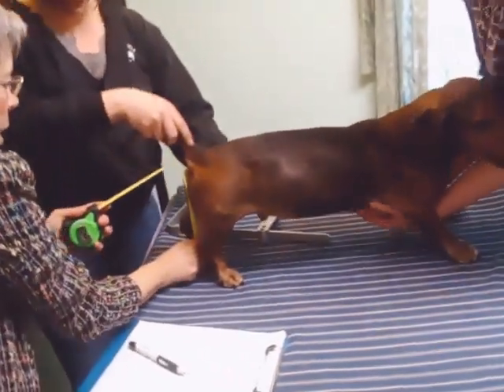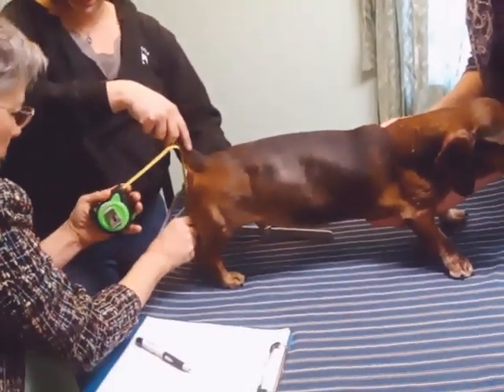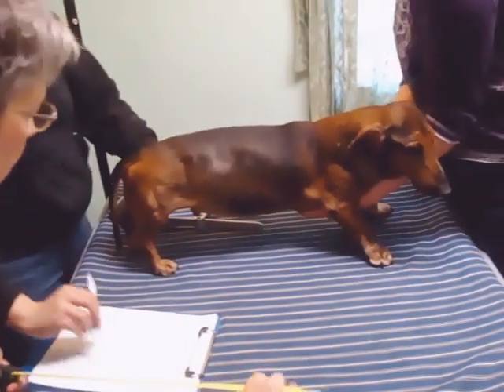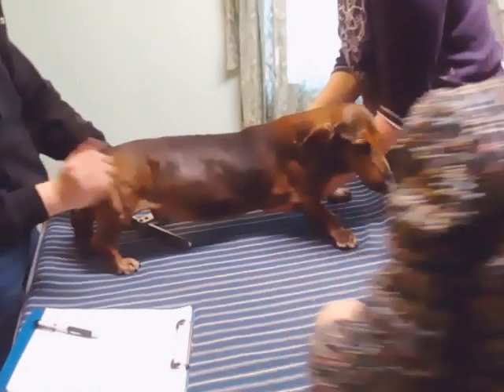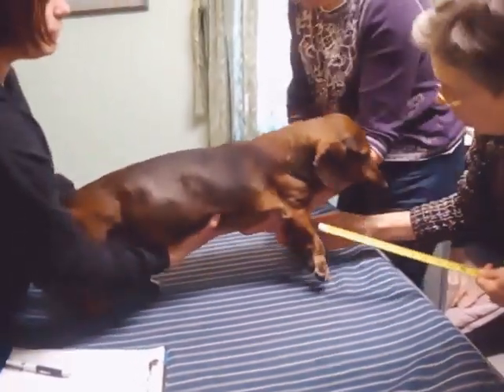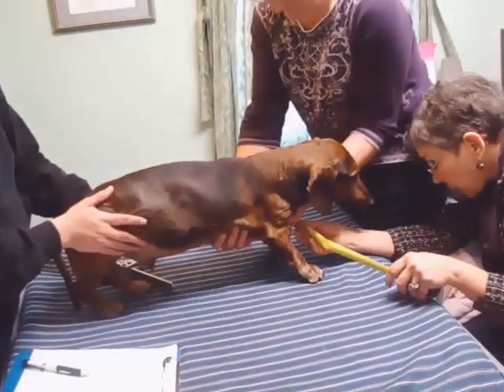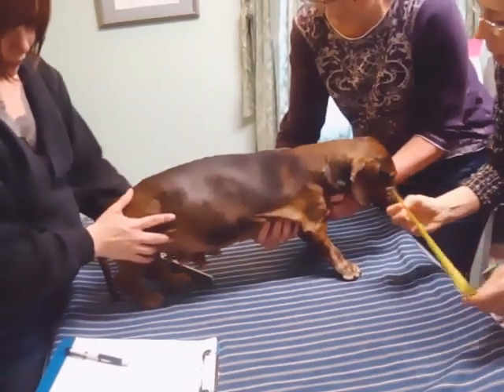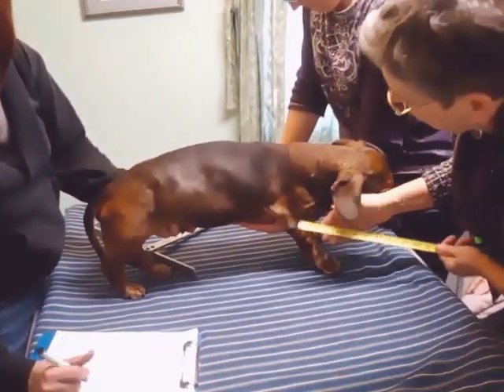For D, you come around, put your finger between the dog's legs, and measure to your finger — six. Skipping E for now, F is the space between the front legs — three and a half. This helps us to design the harness.